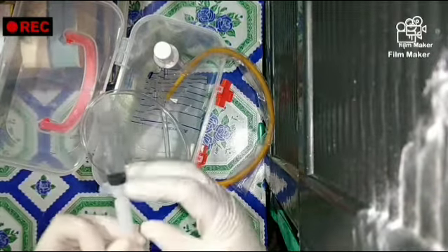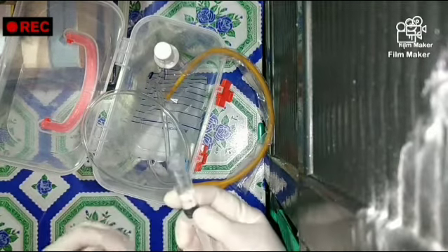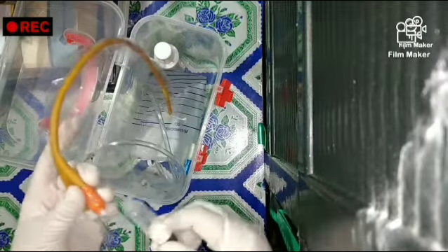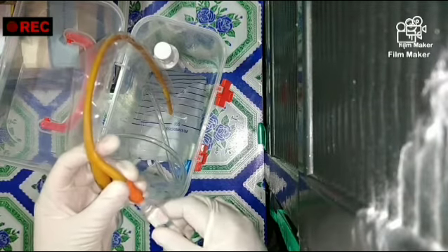So I assume that I have a 10 cc sterile water, and I will attach the water syringe to the catheter and to the drainage bag.